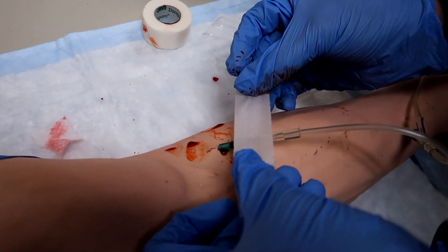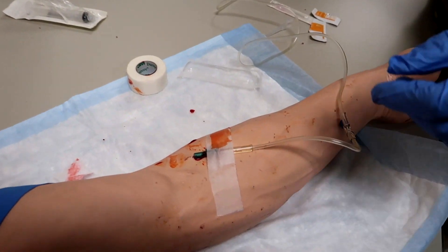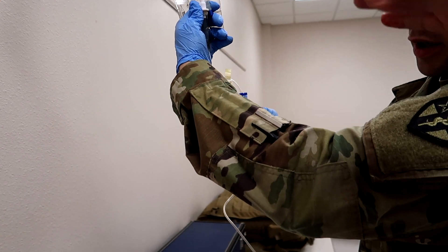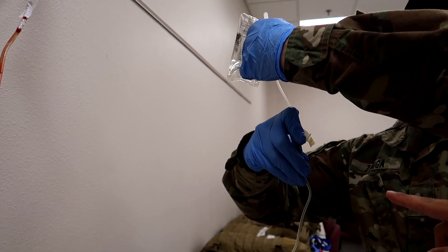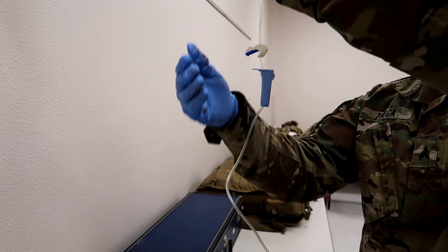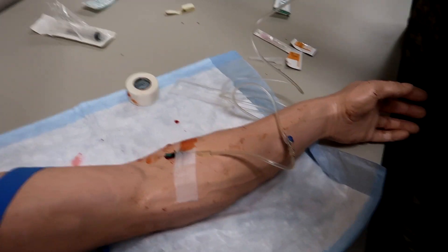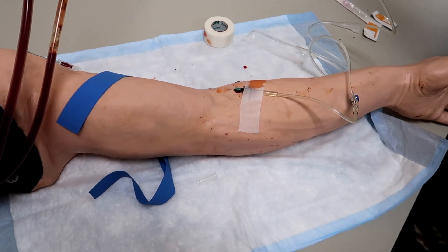Comment down below what skills you want to see in the future and what other 68 Whiskey content you want to see. Now that the tape is in place, he would pick up his bag. You can hold the bag on top of it as well. Then come over here and initiate the flow of fluids — release that, pull it up, and flow of fluids would begin. Now he would verbalize and assess the IV site for any signs or symptoms of infiltration. Go ahead and assess the IV site — you see no signs of infiltration.